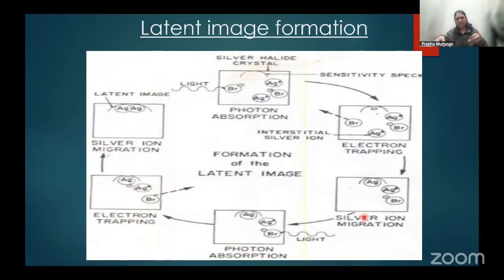Wherever fewer or no X-ray photons are captured, those silver particles will not be there. Okay, so basically that is the concept. Wherever there is more X-ray absorption, the sensitivity site is going to have more silver deposition. Wherever there is no absorption, silver will not be present. So finally, you've got this outline. This metallic silver is going to be spread here and there.